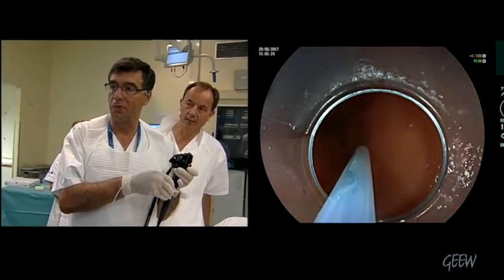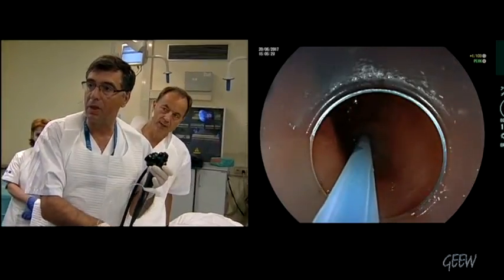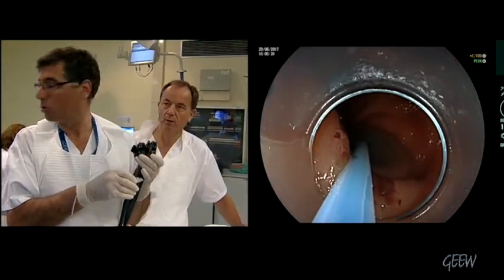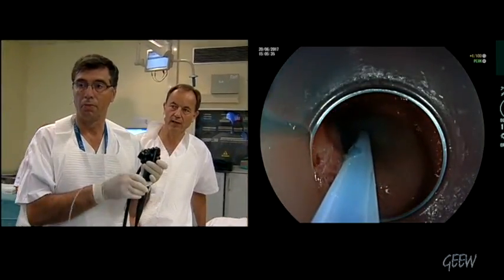The aim is to prepare a tunnel, as you do for POEM in the esophagus, and then to approach the pyloric muscle to cut the muscle, and finally to close the enterotomy.